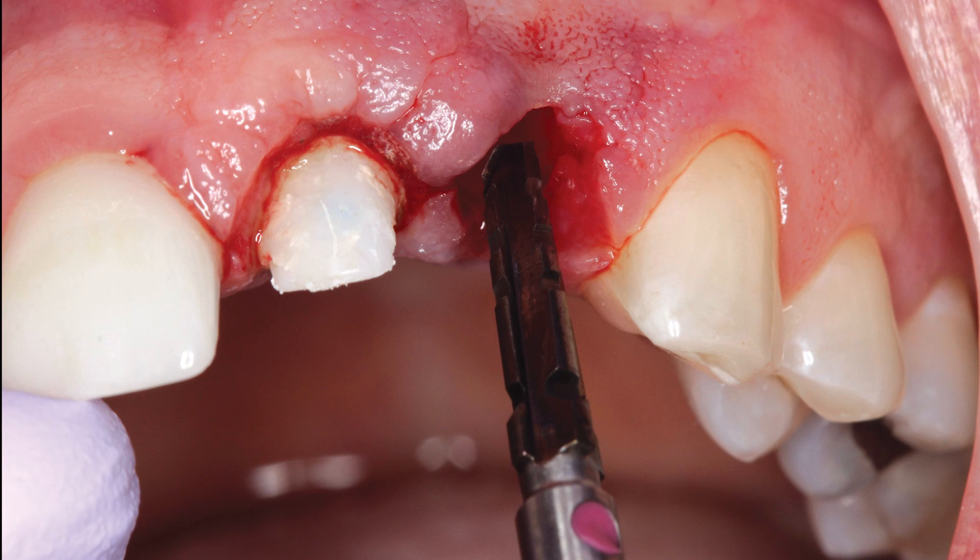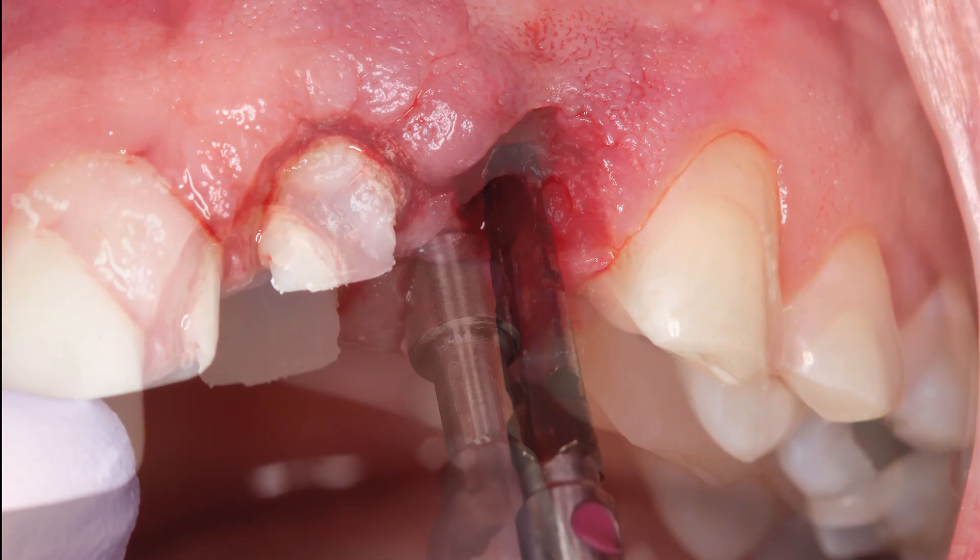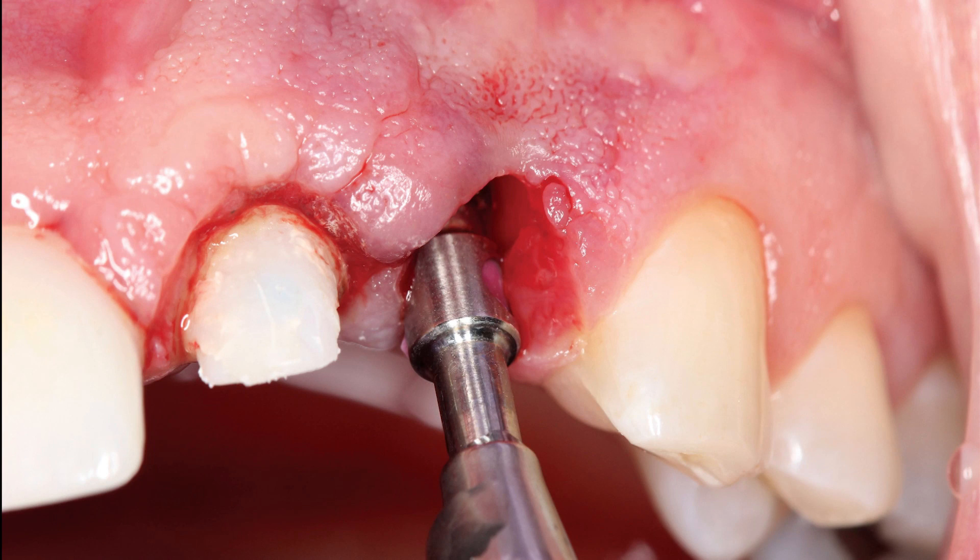A pilot drill was utilized to create the initial osteotomy, approximately 3 mm apical to the adjacent cemento-enamel junction. A 3.5 mm diameter Replace Select drill from Nobel BioCare was used to complete the preparation of the implant site. The Hahn tapered implant system is compatible with widely used implant instrumentation, making it easy to transition to a new implant system.